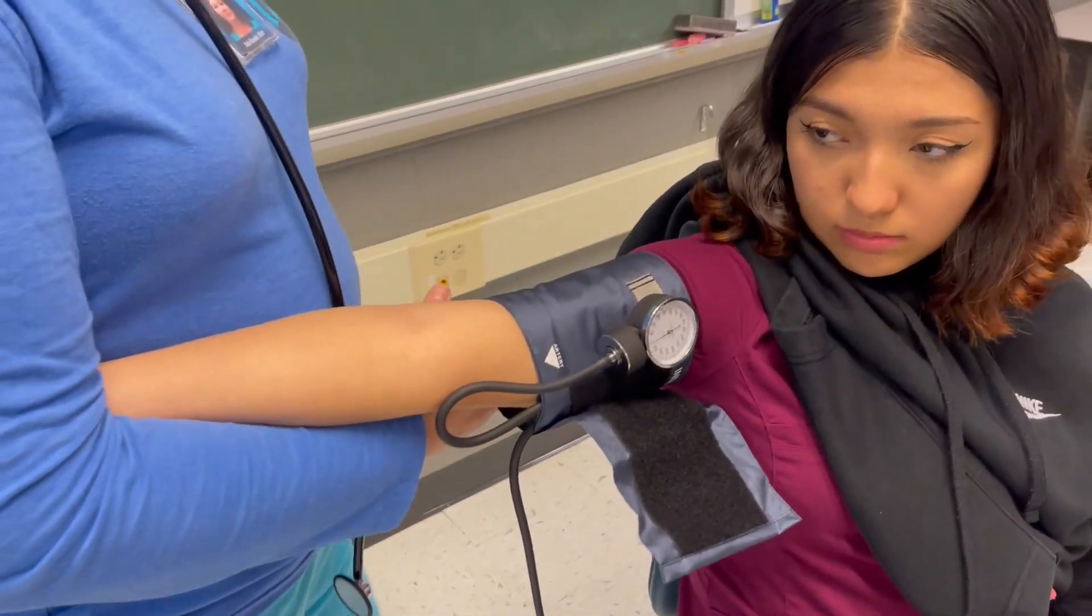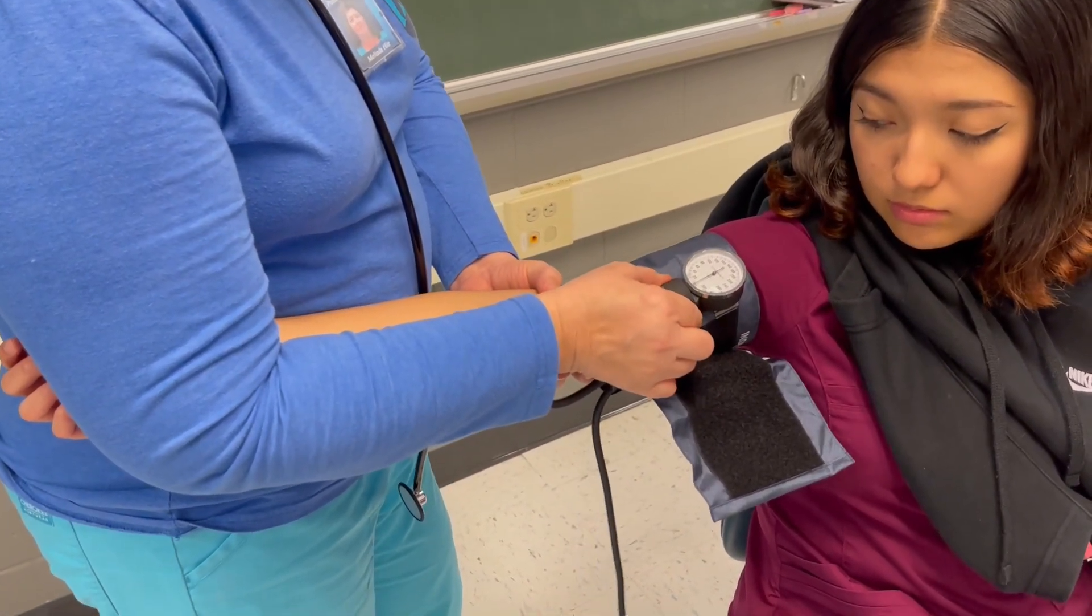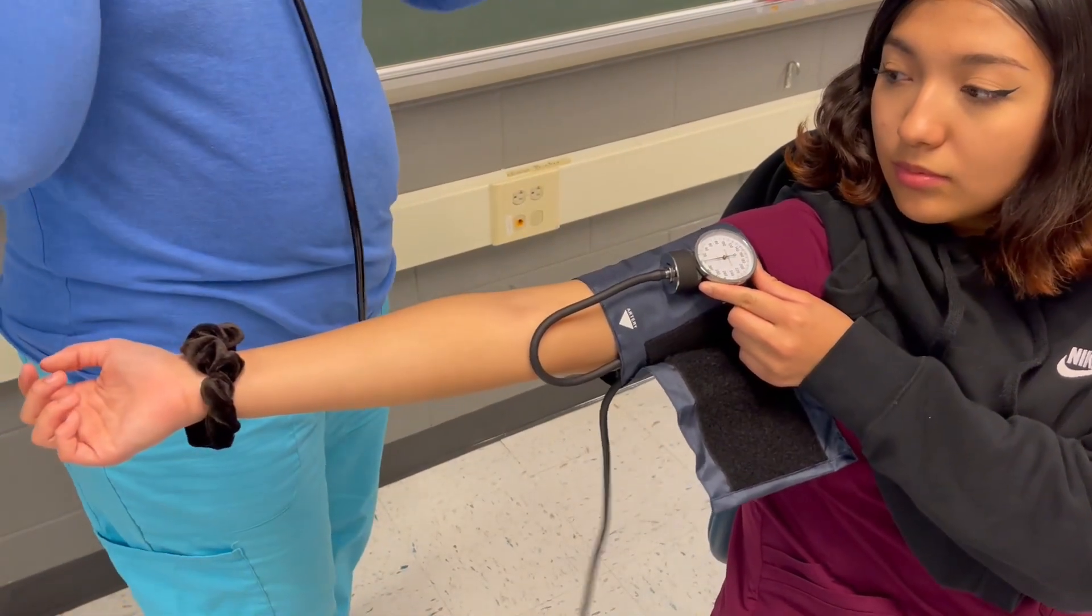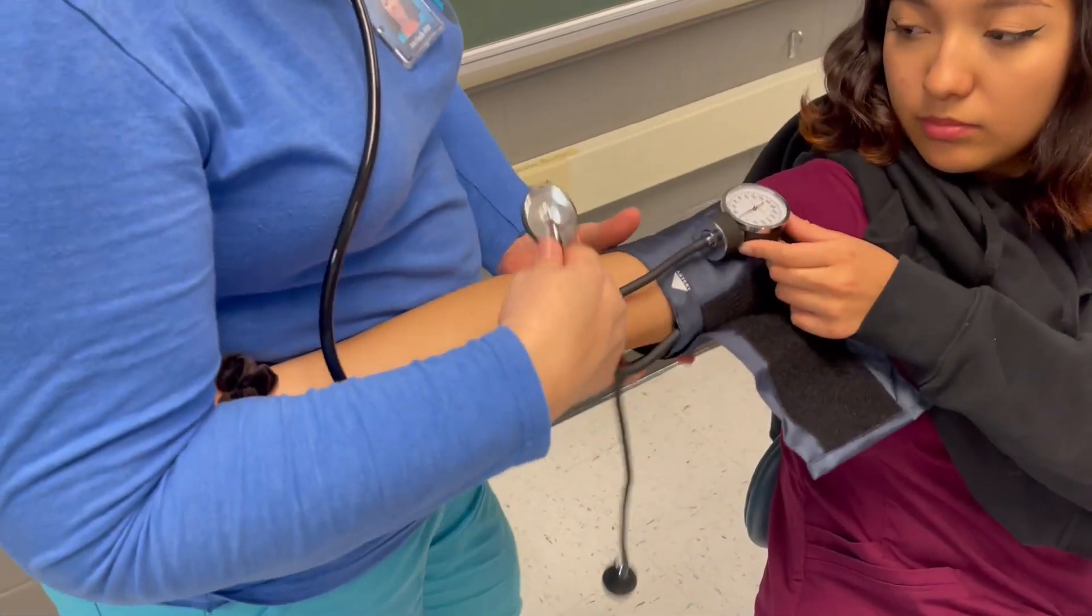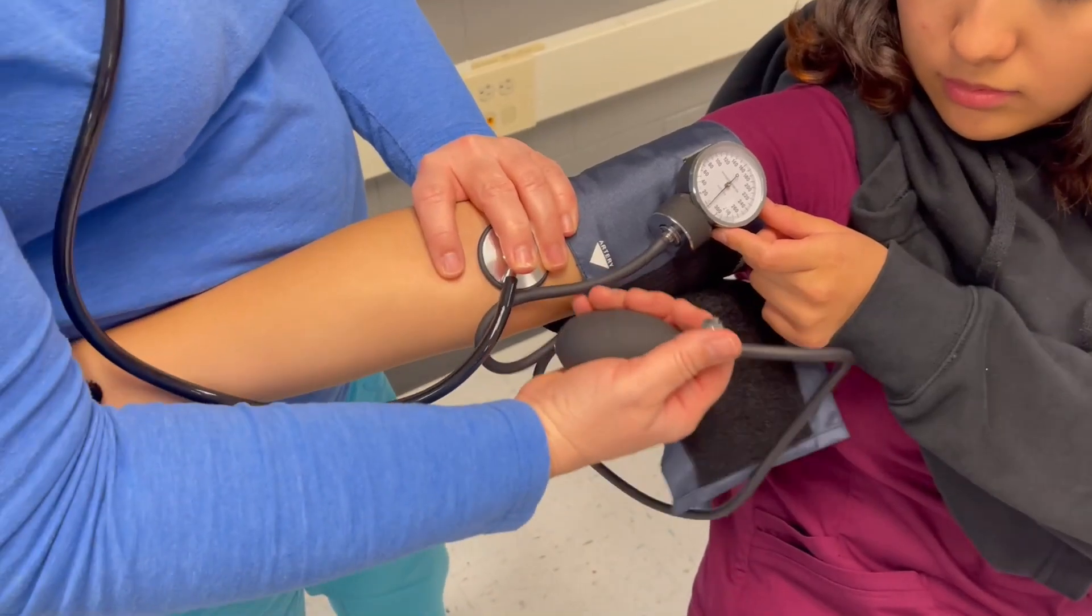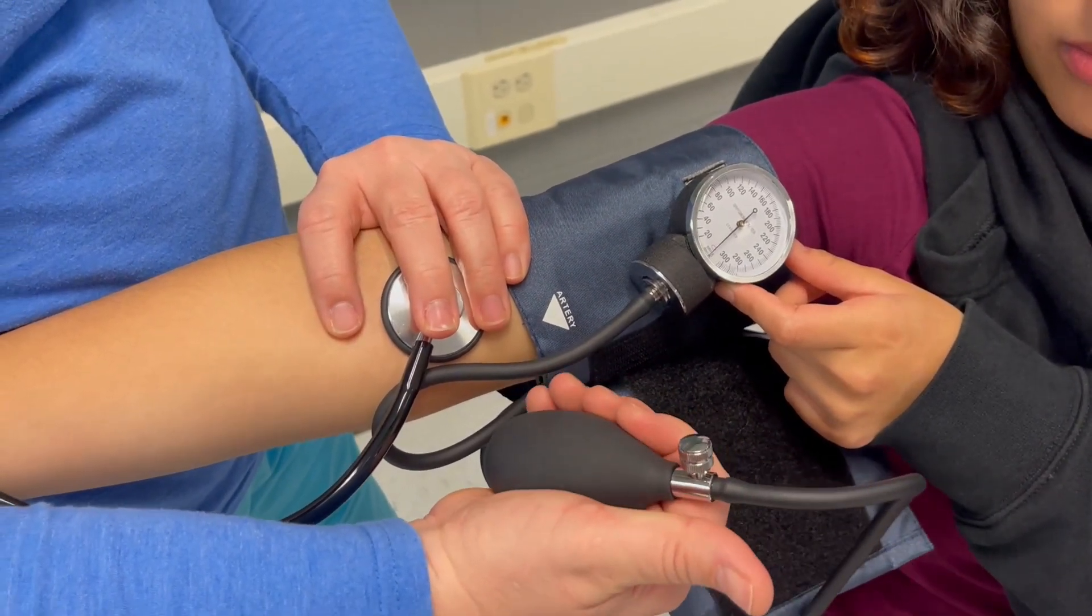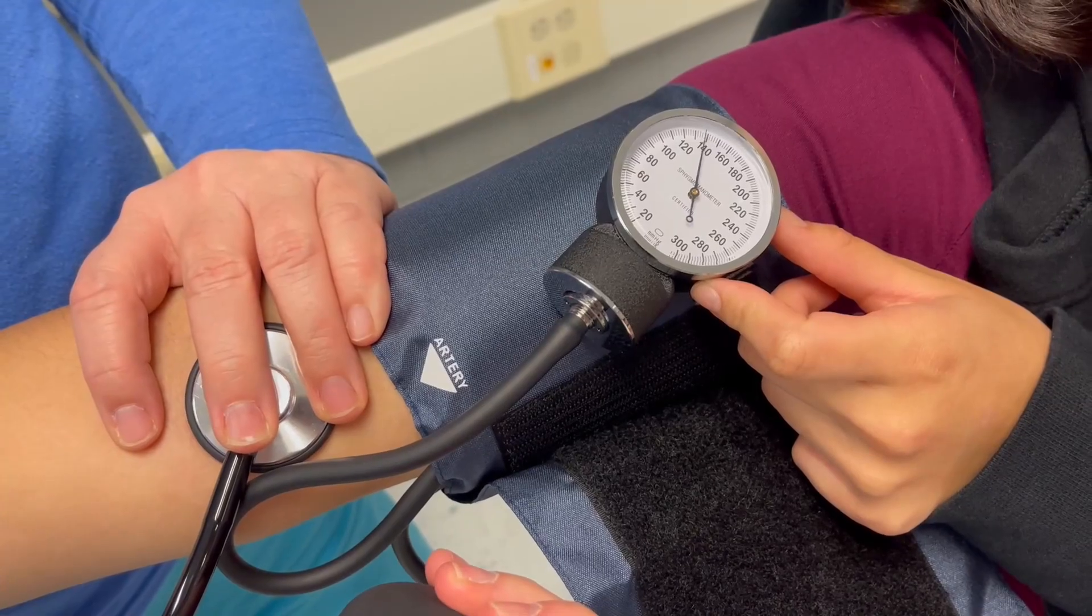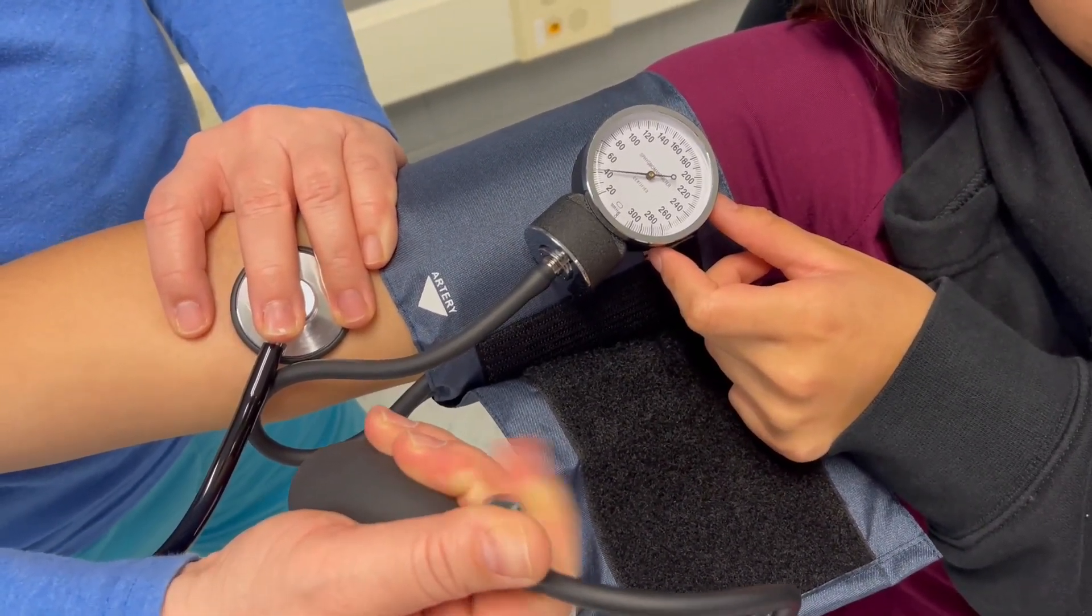Then, I'm going to hold her arm, like this, so that she's comfortable. I also want to be able to see this. So, I might have you hold this for me right there. So, I'm going to put my stethoscope together. I'm going to hold this in place, righty-tighty. Are you comfortable? Yeah, I'm doing.